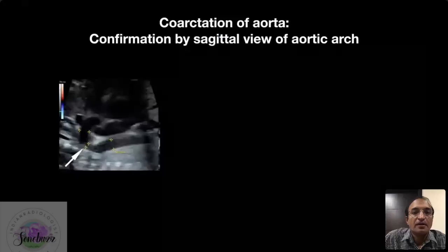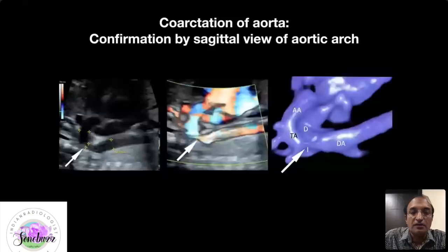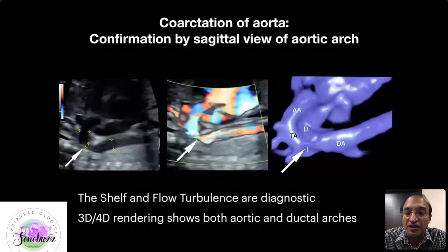Confirmation of the diagnosis is made by using the sagittal view of the aortic arch, where you see the narrowing that is very highly suggestive of coarctation of the aorta. The last picture is a 3D rendered image showing both the aortic arch and the ductal arch, the ductal arch marked as D just below it.